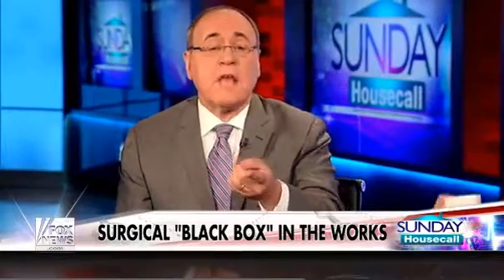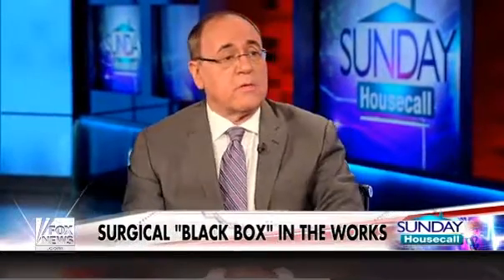What about the legal issue? Okay, so that's the other side of the coin. We're calling this "let's go to the videotape." You know, is it a foul ball or is it a fair ball? And the studies coming from Canada are showing, and they use the laparoscope for this, which is not exactly what David does with a robot, but they attach the camera to the laparoscope, and then they had another camera looking down, the view from above. And they found about 20 mistakes per operation that were missed otherwise.